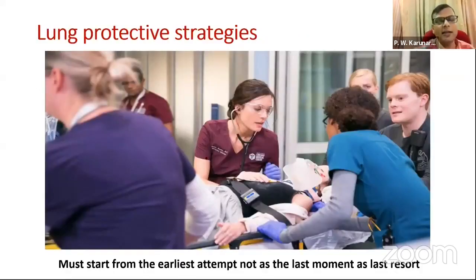And lastly, the last thing I want to tell you: these lung protective strategies have to be started right from the beginning. Don't let the patient have very high tidal volumes of 1000 ml or 800 ml, and don't expect the ICU doctors to manage this patient right now. When the patient comes to the ICU after, say, 5-6 days of large tidal volume ventilation, the damage has happened. It's very difficult to save these people. So the lung protective strategy has to be started right from the beginning when you intubate.